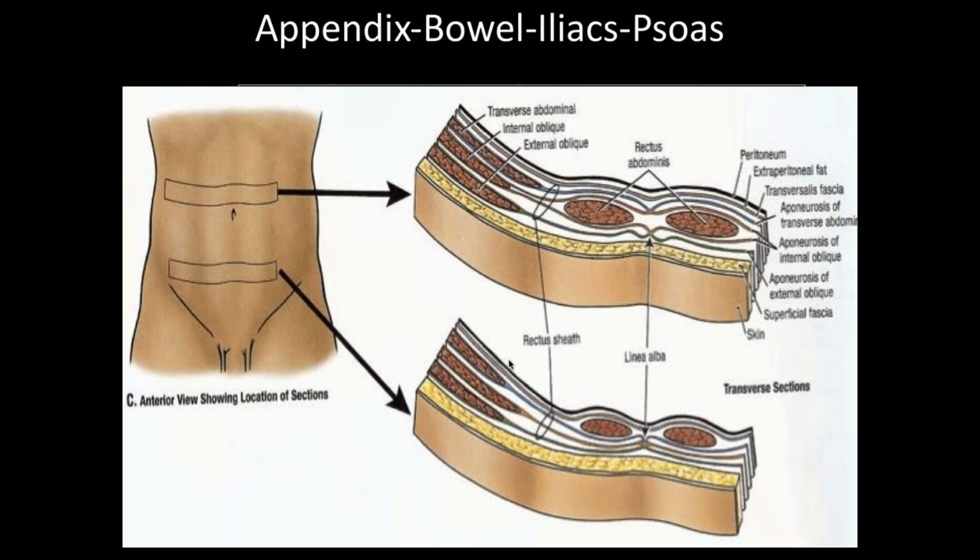And then before we move on to the ultrasound clips in this presentation, I want to go through one last anatomical image because it's relevant to what we're looking at on the ultrasound screen. This is a cross section essentially taken out in the area that's the high yield area, and I want to go through the layers that we're going to see.